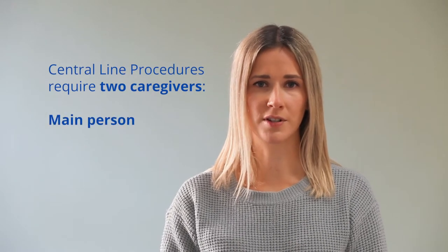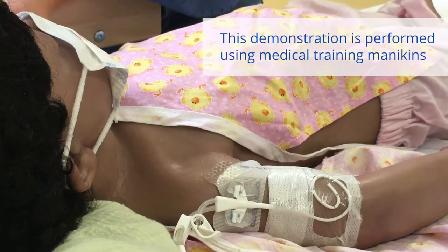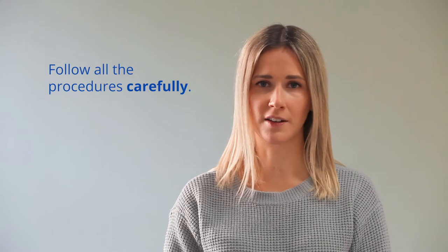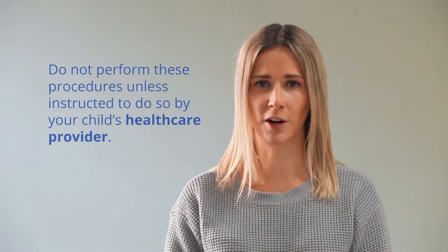Central line procedures require two caregivers: a main person and a support person. Your child's health care team may teach you how to complete central line procedures at home. It is important to follow all procedures carefully to keep your child safe. Do not perform these procedures unless instructed to do so by your child's health care provider.